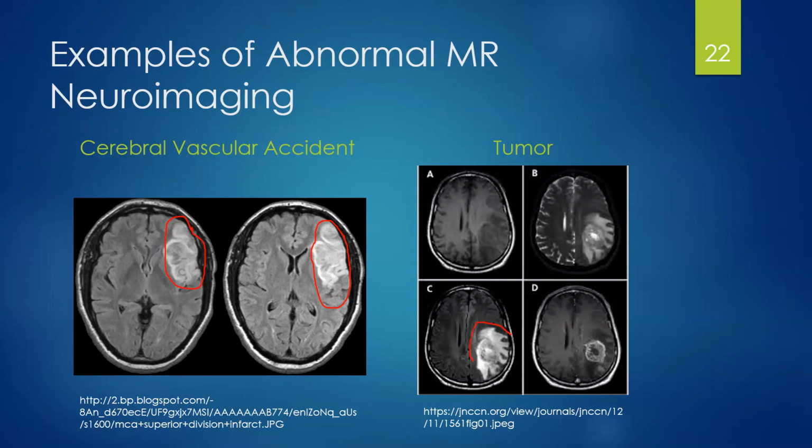So once again, we're getting these very big bands of abnormal tissue, and as we talked about, looking at, are we healthy and consistent? This stuff looks the same here on this side too. That does not look like native tissue. Same thing here, where you have these vastly different, weird, abnormal looking stuff that doesn't appear anywhere else. They're very marked, and even get into that native lesion there, into some of the spreading edema that it's creating into its surrounding tissue.